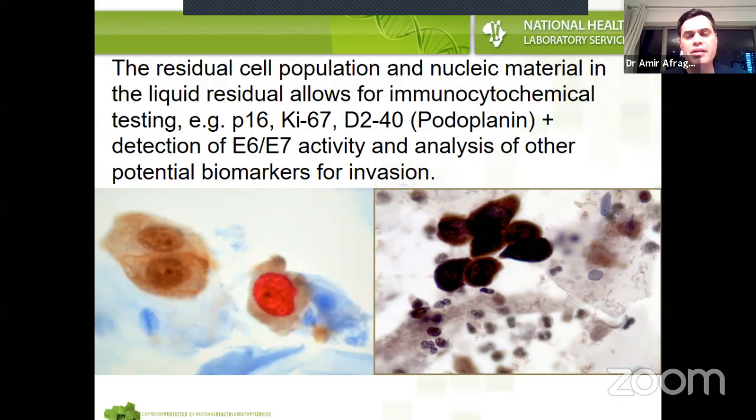So this dead tissue, or this tissue injury, is the result of the mouth rinse. Like I said, it's quite nice to do additional things with liquid-based cytology. You can test the liquid for the presence of high-risk HPV, or you can stain the cells that you have obtained to find and classify these cells, or to do additional investigations.